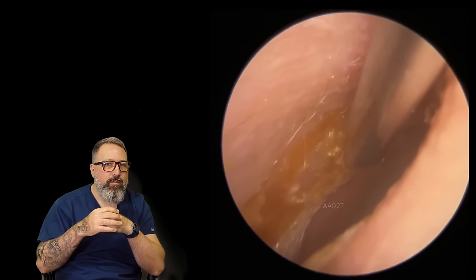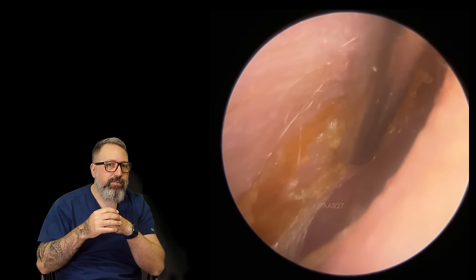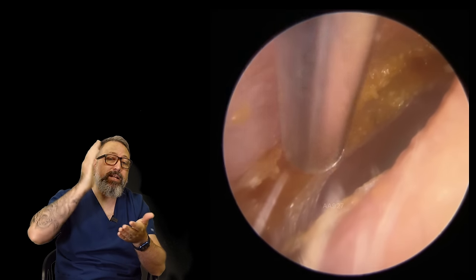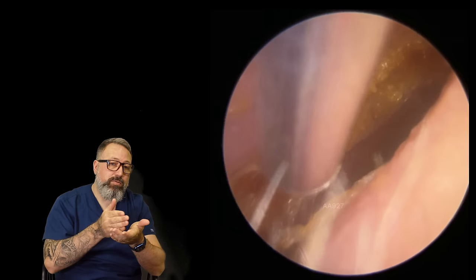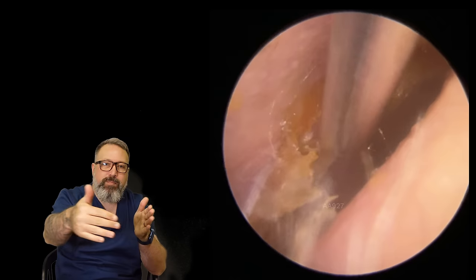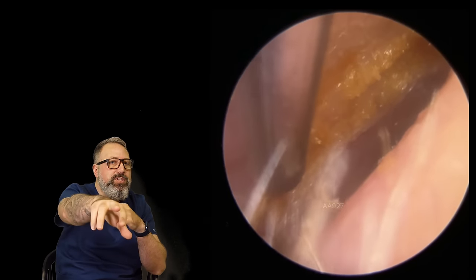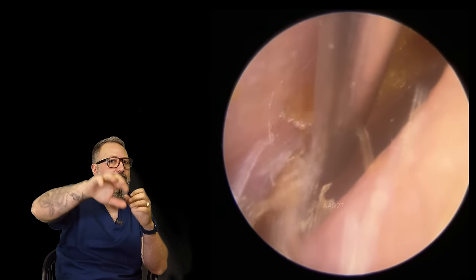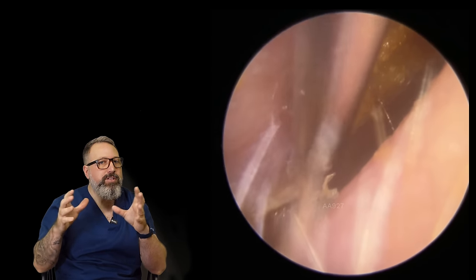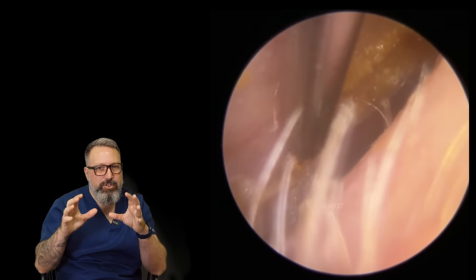So we've got the fine end on here. Now you can see he's got a very, very pronounced bend in the ear canal - very difficult to see all the way around. Because the endoscope we use is a rod - basically just a straight tube of metal with some optic fibers and a lens inside. Because you're trying to get into this sort of bendy ear canal with a straight object, it's very difficult to do. Now you can see where I talked about this dry ear canal - we're in that deeper section, and what we've got here is a lot of keratin, a lot of dead skin, it's died off and it's just sitting in this deeper section.